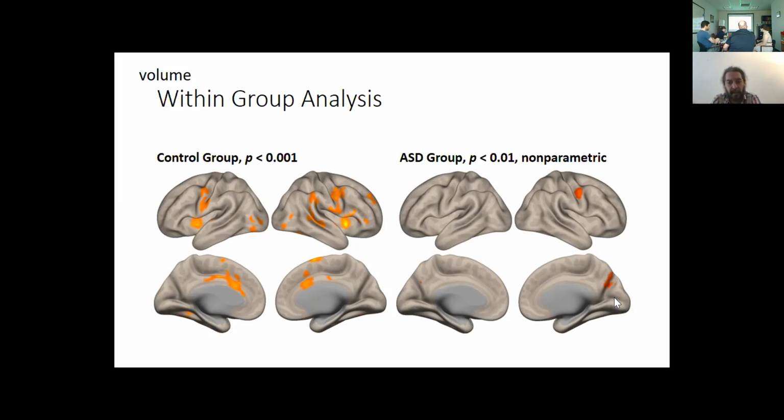So if you enter the motion variables in the ASD group as the motion ASD covariate, and you center those variables so that the average within the ASD group of the motion is 0, then when you look at the 1-0 contrast, it is looking at the ASD effect. So you have ASD and motion ASD and enter a 1-0 contrast. It's going to tell you still the same thing, the average activation within the ASD group.